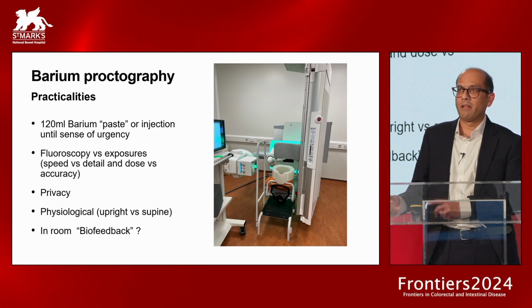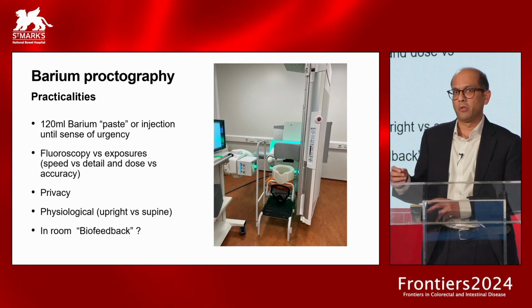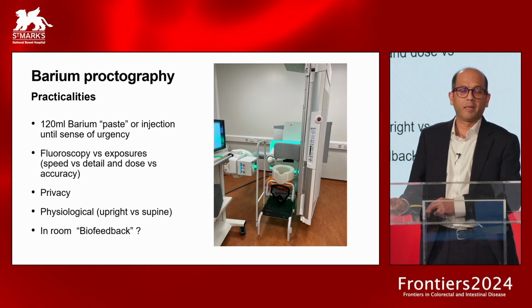Now, obviously, the key difference there is that the radiation dose is something that we are going to be very concerned about, particularly in young patients, and there is a much lower dose with the use of fluoroscopy as opposed to taking x-rays. But the flip side of that, though, is that you're not going to get the same detail. So again, using the analogy of a video compared to photographs, you can't get that high resolution with fluoroscopy. So there is sometimes a bit of a balance to get between those two.